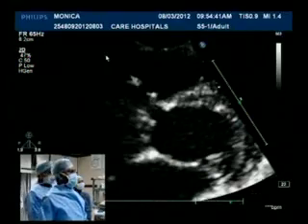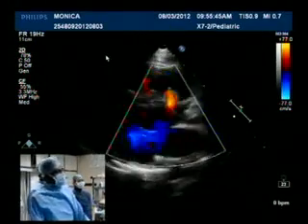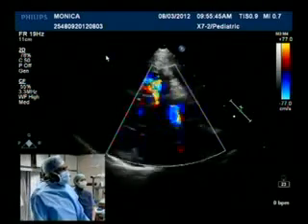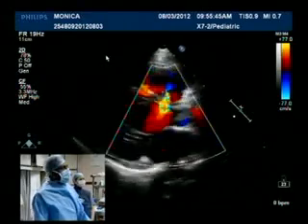So it's unlikely to, so you're going to take 6 into 6 now? 6 into 4 we take, our experience shows 6 into 6 at the membranoseptal location will actually eject into the LVOT. So I think 6 into 4 should be okay.